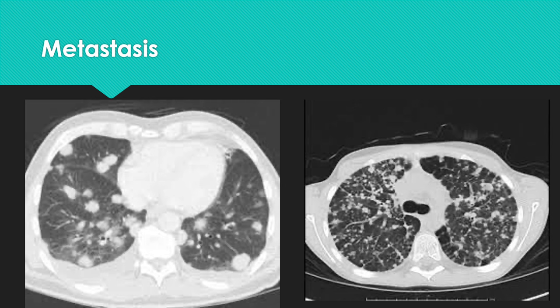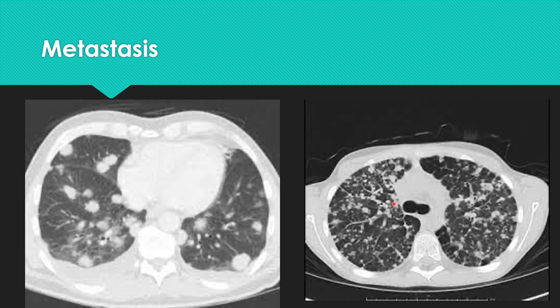Metastatic nodules have been typically described as 'cannonballs.' They may be random — some subpleural, some central, some along bundles, some bronchogenic. They are well-circumscribed nodules, varying from tiny to very large. The second example shown is papillary carcinoma thyroid metastasis, demonstrating well-circumscribed nodules that vary in size but are randomly distributed.